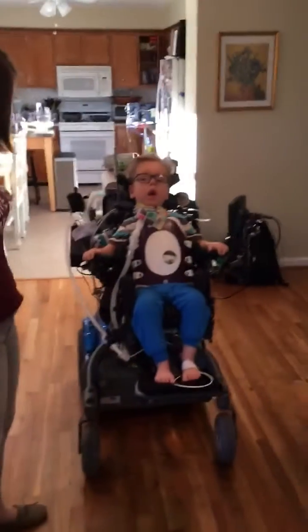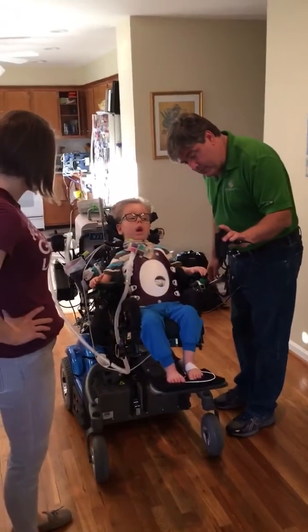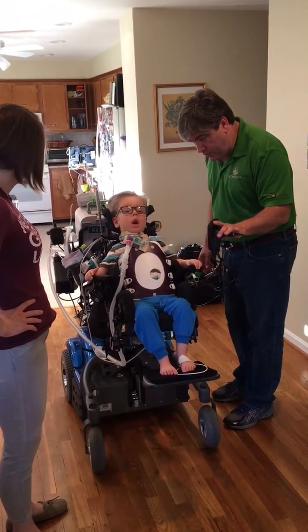You're recording? Yes. Okay. So, I am going to move this into your control. Okay, bud? Are you ready? One, two, three.